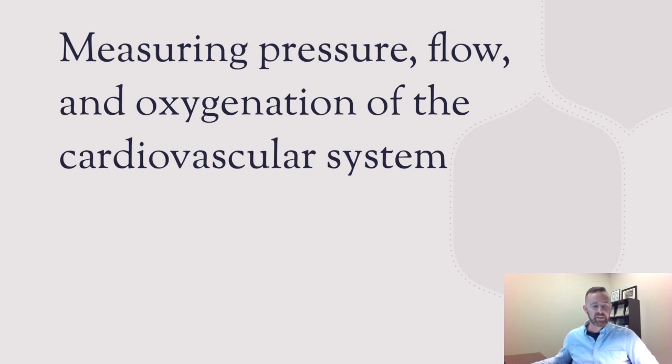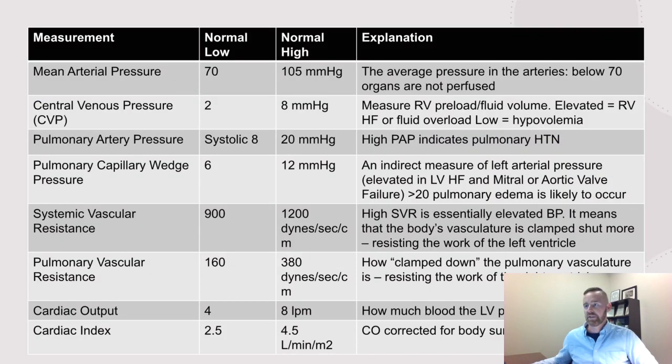All right, so let's jump into a little bit more detail. We can put in a central catheter, pulmonary catheter, otherwise known as a Swan-Ganz catheter, which we'll talk more about in a second. They can give us a lot of different pressure readings. The first of those is we can do this with a blood pressure, or we can also do this with an arterial line.